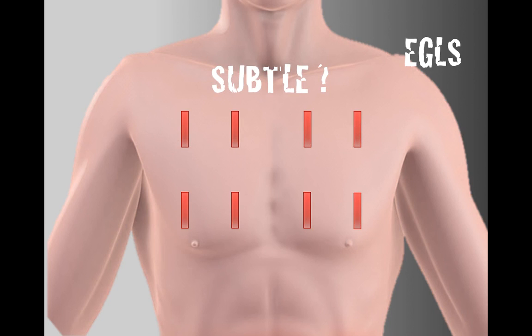If we're looking for subtle ones in stable patients, we'll want to cover 4 main regions on each side. So one around the second intercostal space and another one around the fifth intercostal space. And we'll look at the medial and lateral part of each of these regions. And that will give us a total of 8 interrogation points. Of course, there are many types of chest, so look at the patient and actively ask yourself, where would air go? That sure can't hurt.